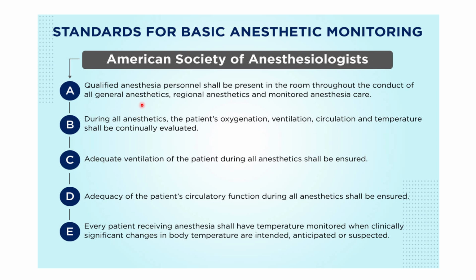Whoever this is, the resident, assistant lecturer, specialist, consultant, or anesthesia technician, should be qualified and present in the room all the time during conduction of anesthesia, whichever method you are doing for the patient: general anesthesia, regional anesthesia, or monitored anesthesia care, abbreviated as MAC, or conscious sedation.